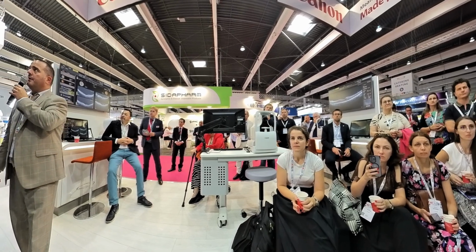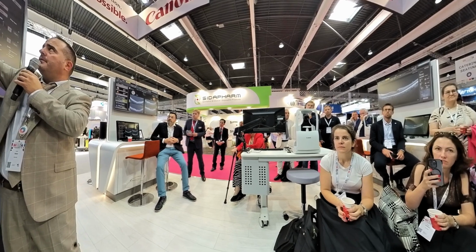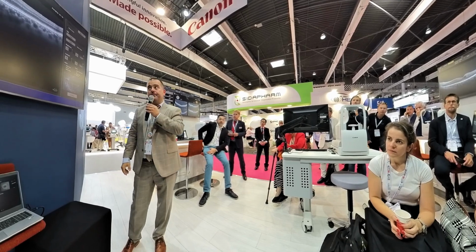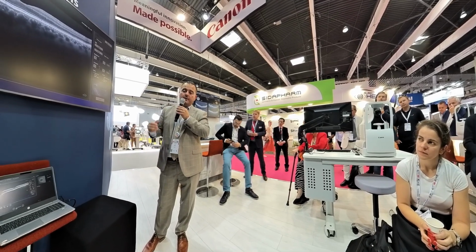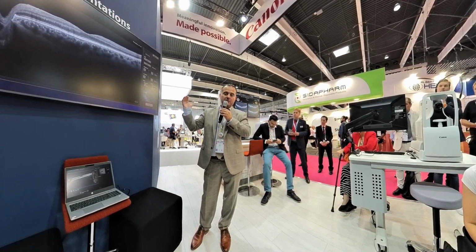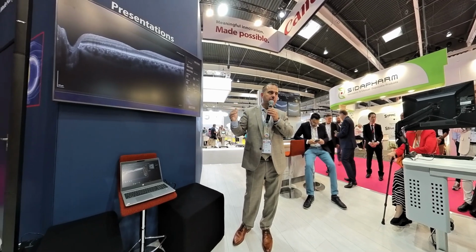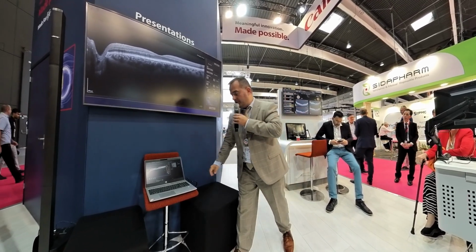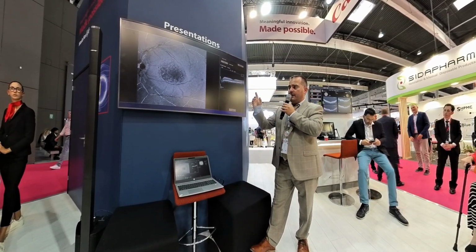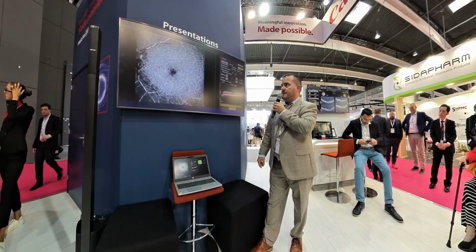This is also imaging of this problem of the inner plexiform layer where the ischemic incidents occur. So if you don't have enough resolution and enough image quality, you might miss the reason why you have a suboptimal outcome of your vitreoretinal procedure. Again, a vascular incident, the AMN. Also a similar condition.